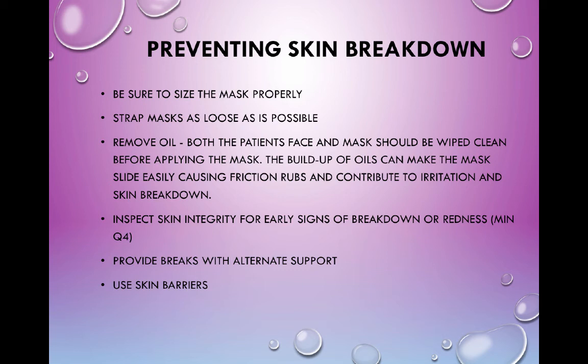I know you guys take masks off to give pills and things like that. If there's oil on there, clean it off, clean their face. What happens is the oil slides around and it starts to chafe. And I actually just learned that as I was putting this together a few months ago. I never thought of that when I did patient care. I just said, hey, stick that thing on there. But the oils will actually make it slide around and cause chafing. And then once they get a sore, you're kind of stuck.